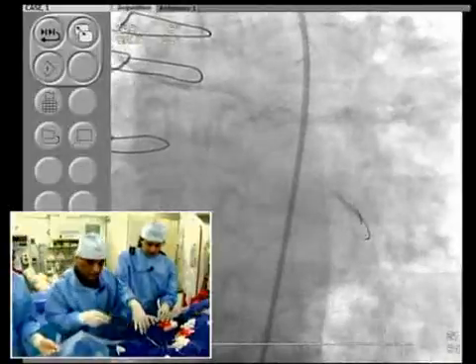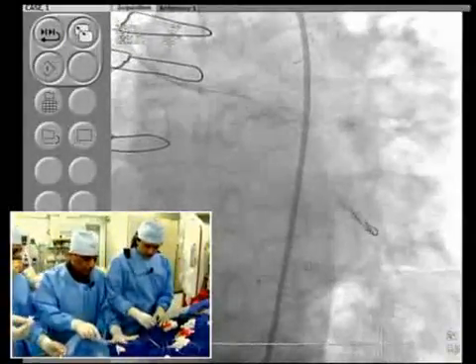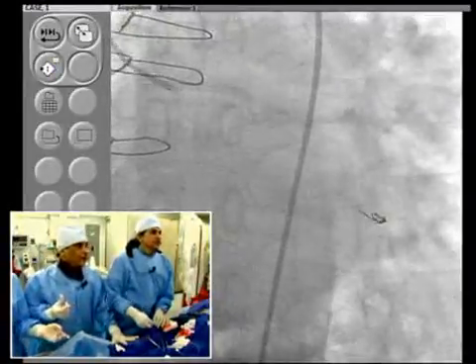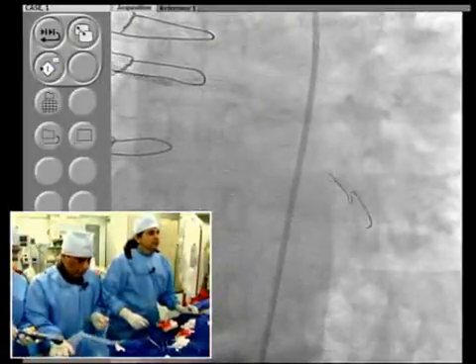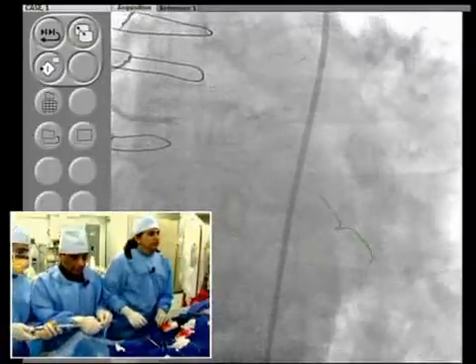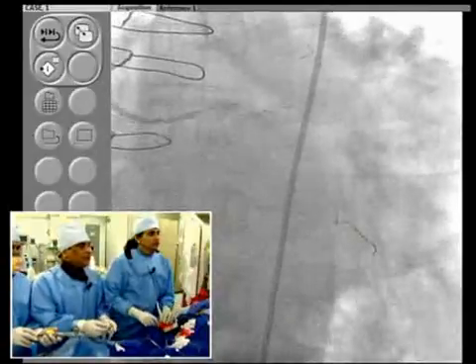Actually, I could have shown you stent boost today, but with a little glitch here, it's not working. But you can see the stent proximally as a funnel, opening proximally, and then it's the tapering stent. You can call it a tapering stent. Yes, we can do it, and it's very simple, particularly with the Zions, knowing that we are deploying the stent at a low pressure, 10 to 12 atmospheres.